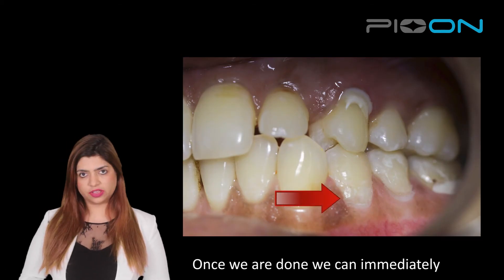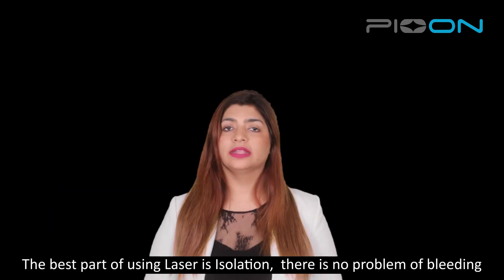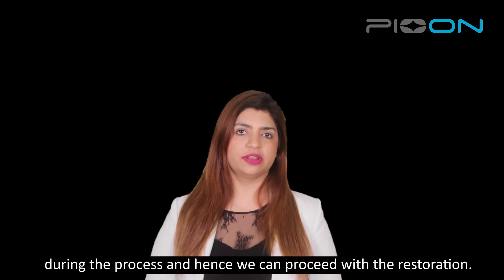Once we are done, we can immediately follow it by a composite restoration. The best part is, because of the laser, there is no problem of isolation and we can proceed with the restoration.